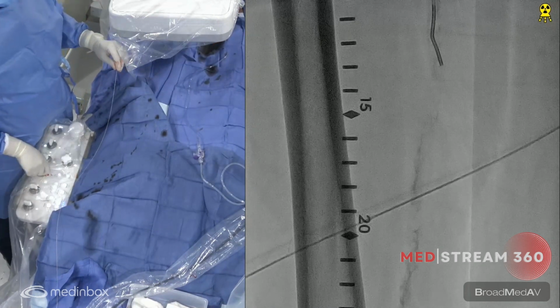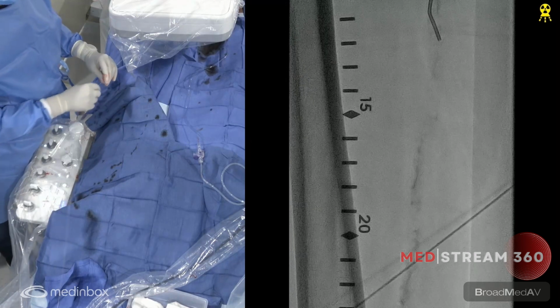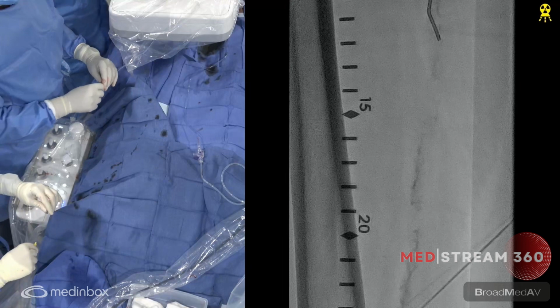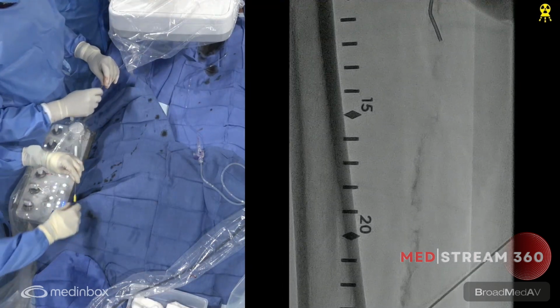So as you saw, it's not a very challenging, I mean, it is challenging because it's calcified, but it's not a terribly difficult cap, although calcified caps can always give a lot of trouble to us. So you can see here, we're just going to go down, and I'm just going to try to engage this cap with this. Let's see how it behaves.